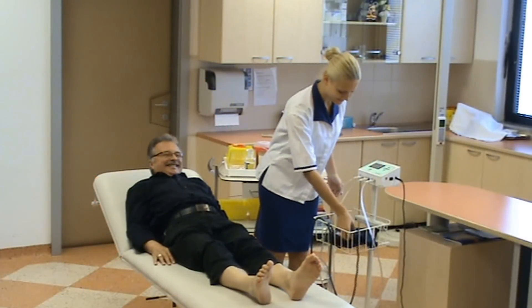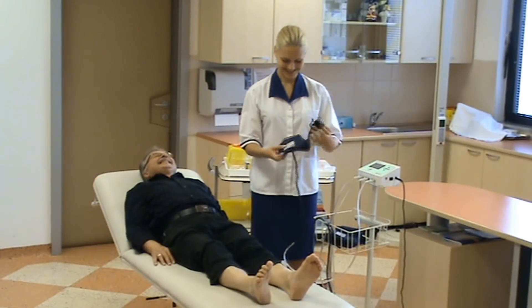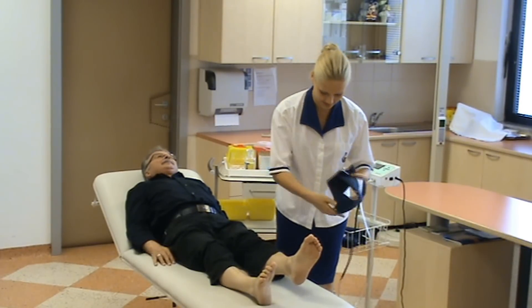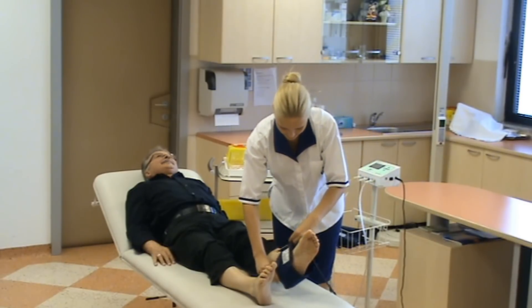Let's see how the measurement is done. The patient is in recumbent position. A nurse or doctor places the cuffs on each extremity. The measurement starts when the start button is pressed.